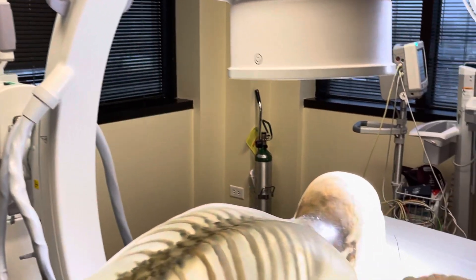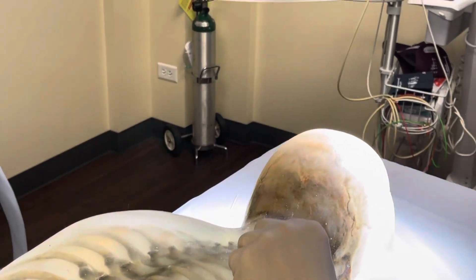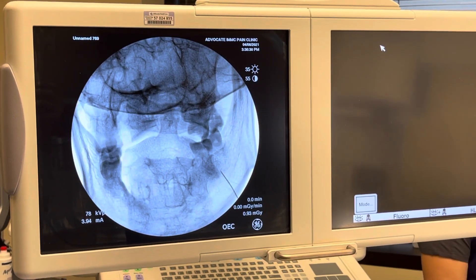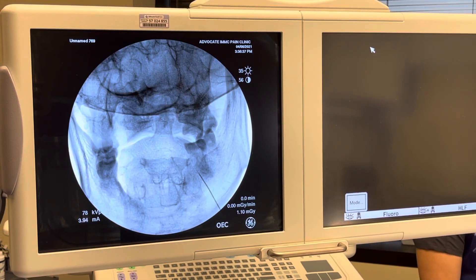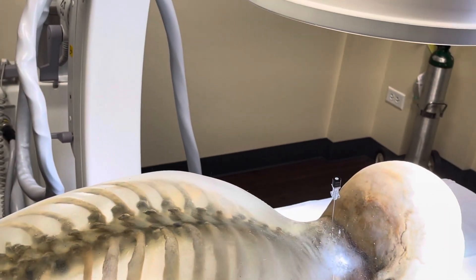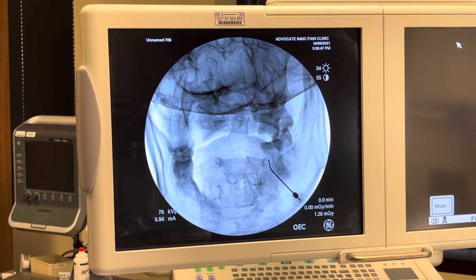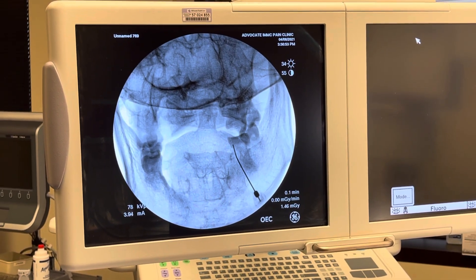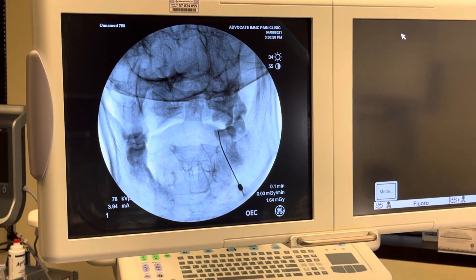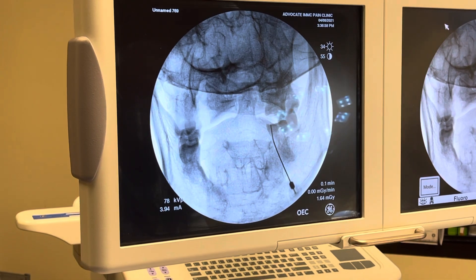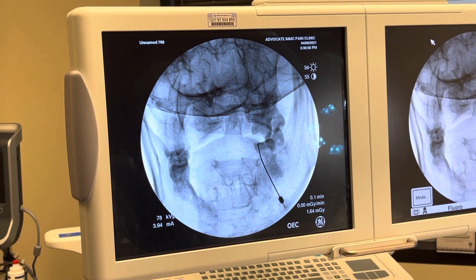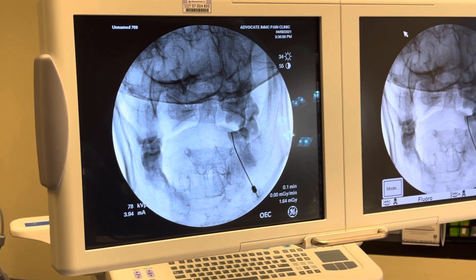After anesthetizing the skin, I assess my anatomical landmarks using fluoroscopy. Starting off somewhat lateral, I gently move medially to the right side. I make my skin entry point through my local anesthetic skin wheal and gently drop my needle down towards the atlanto-axial joint, not advancing more than about two centimeters. I then move laterally — entering the joint space in the center of the joint space, because we anticipate the vertebral artery swinging out laterally to medially. By staying in the center of the atlanto-axial joint, I minimize trespass on the vertebral artery.